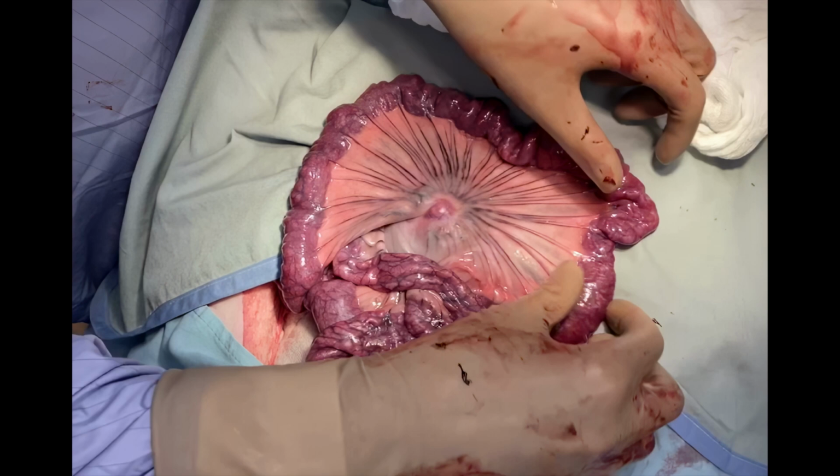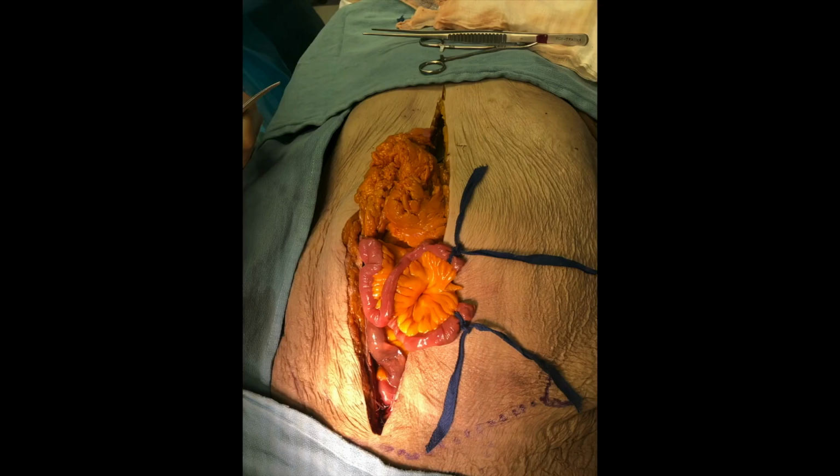Note that although not demonstrated in this video, to prevent spillage of enteric contents, non-crushing clamps or ties, as shown here, can be placed on either side of the section of bowel planned for resection. Note that care must be taken not to damage the healthy bowel.